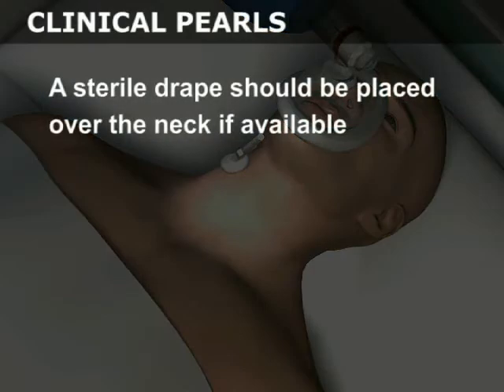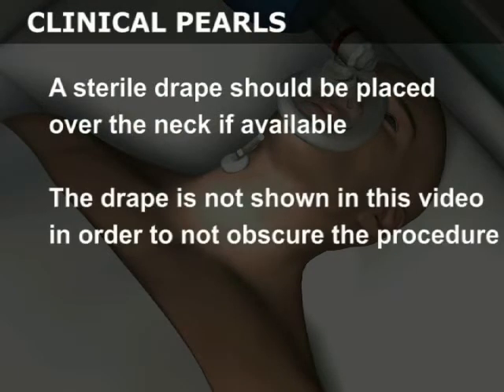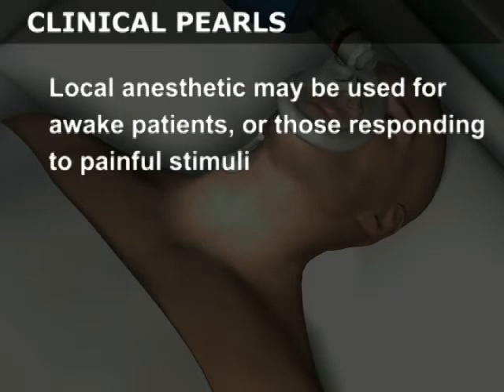A sterile drape should be placed over the neck if available. The drape is not shown in this video in order to not obscure the procedure. Local anesthetic may be used for awake patients or those responding to painful stimuli.